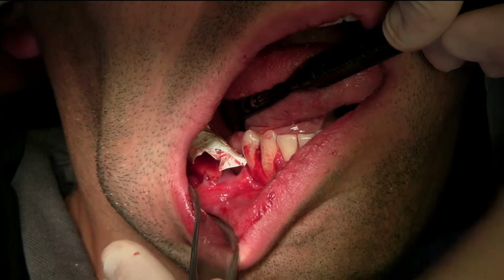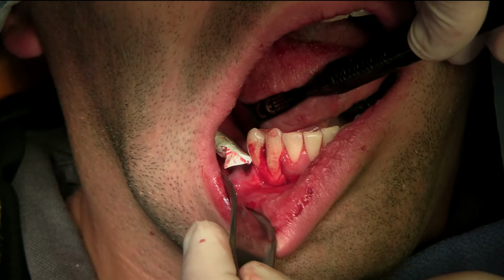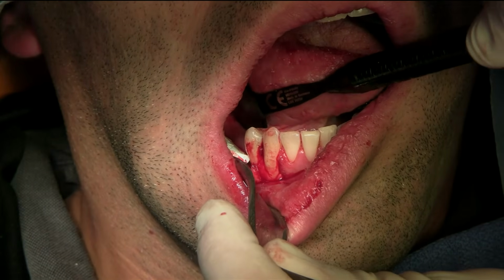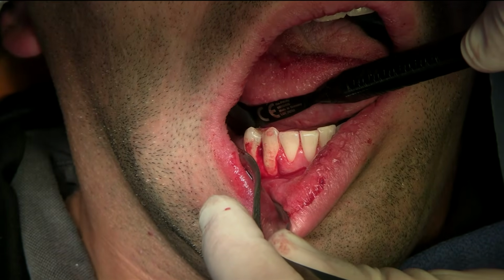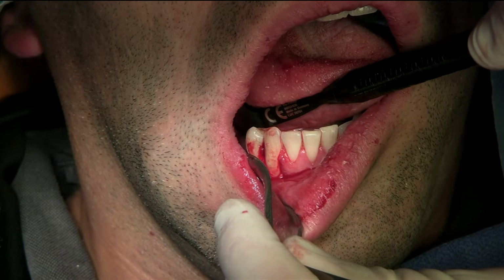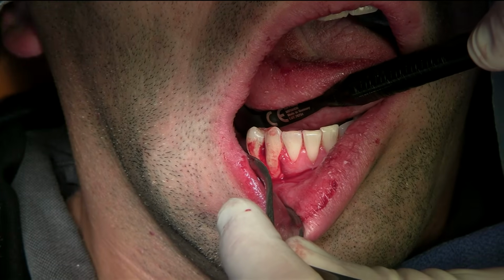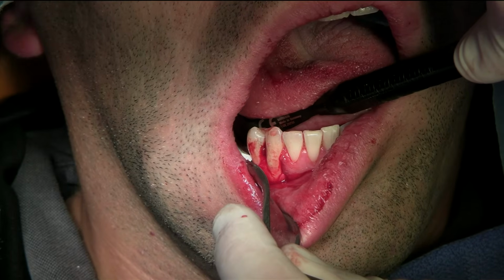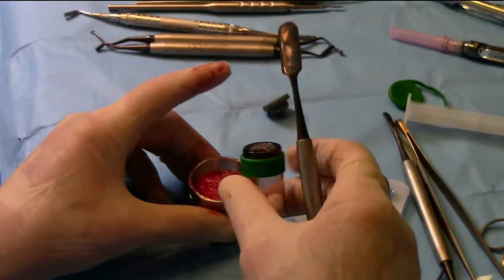We have only half a gram, so I'll just take about, you can maybe take the camera, just to show. Not yet happy, but soon. And when you're done with this, you can bring me some Emdogain. Okay, all three.